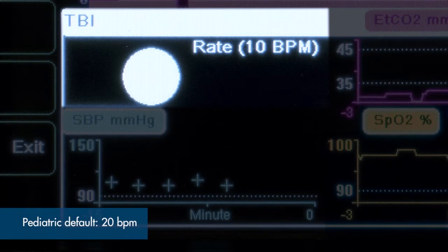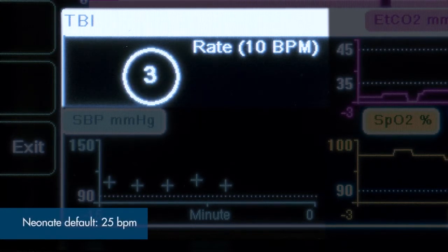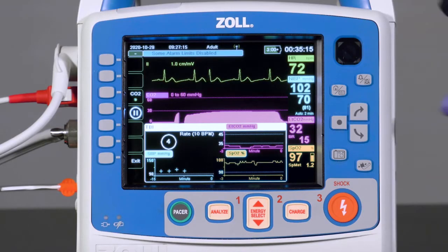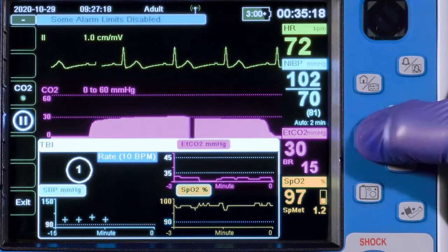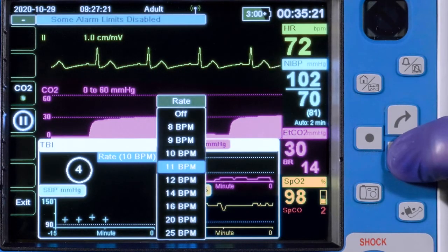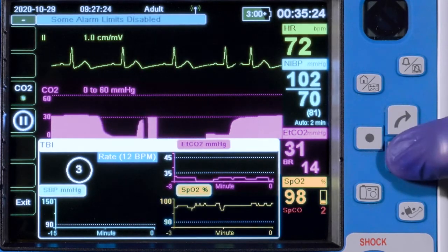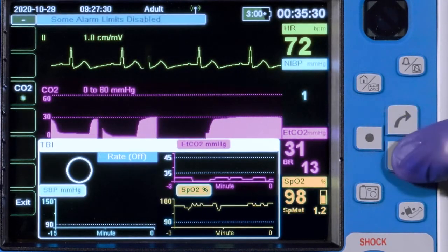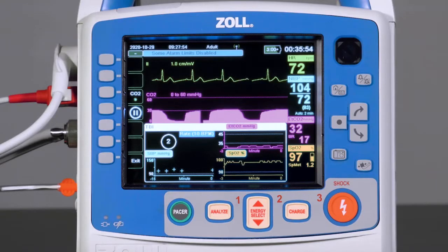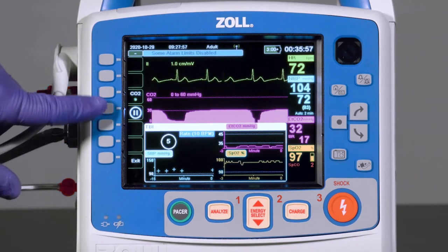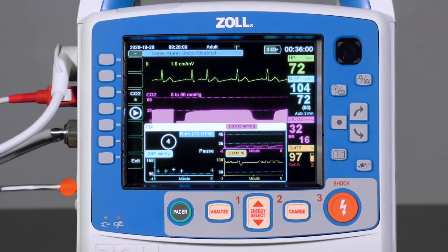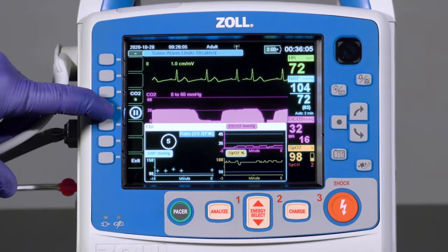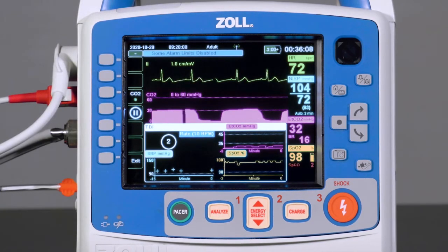In pediatric mode, the default is 20 breaths per minute, and in neonate mode, the default is 25 breaths per minute. The rate can be adjusted by highlighting it, pressing select, selecting the new rate from the available options, and confirming it with the select button. Selecting off will disable the simple ventilation timer if it is not needed, such as when the patient is placed on a mechanical ventilator. The timer can also be paused by pressing the pause QA key on the left side of the device and restarted by pressing the play QA key, now found in the same position where the pause QA key was located.